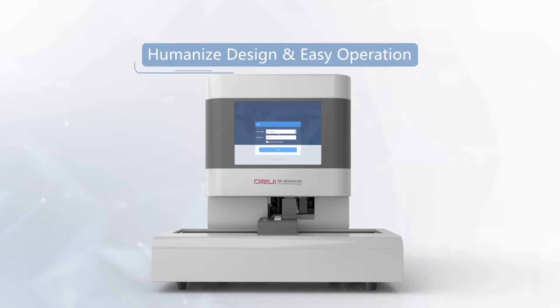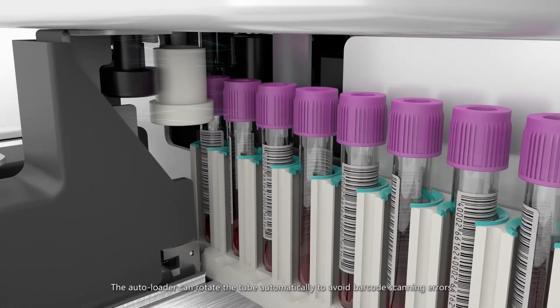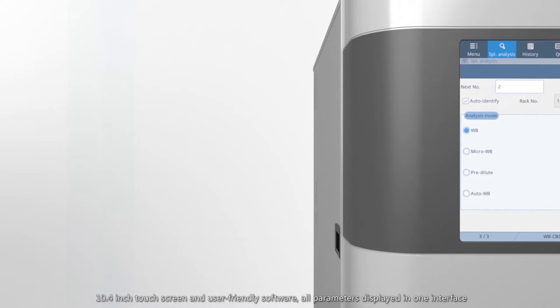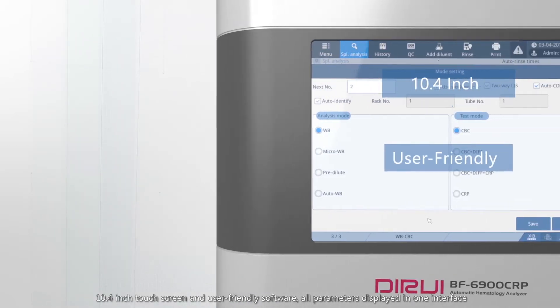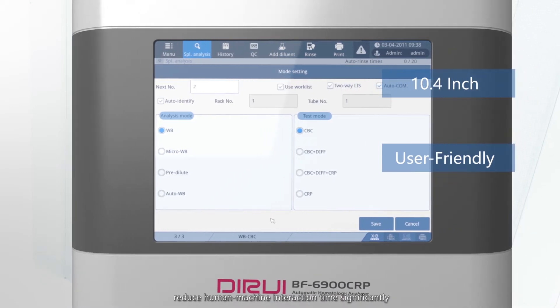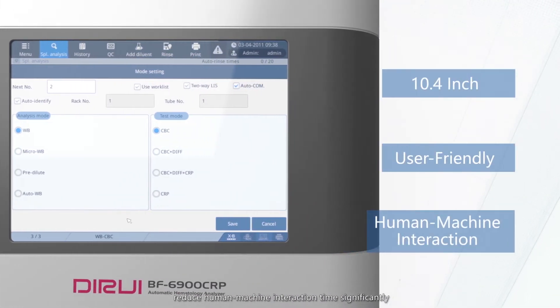Humanized design and easy operation. The autoloader can rotate the tube automatically to avoid barcode scanning errors. 10.4 inch touchscreen and user-friendly software, all parameters displayed in one interface. Reduce human-machine interaction time significantly.